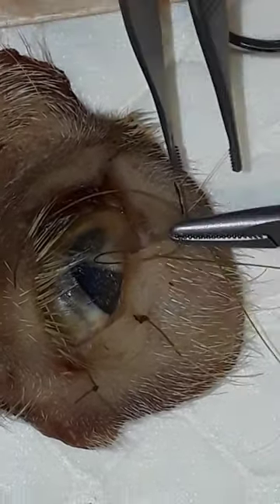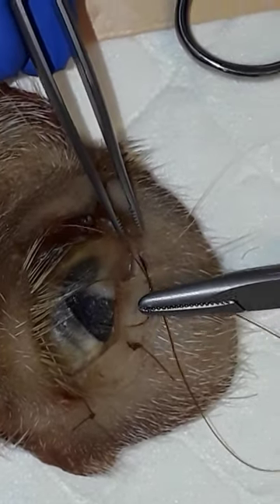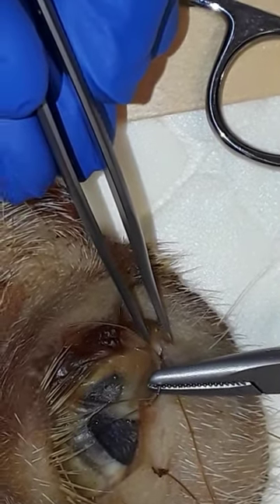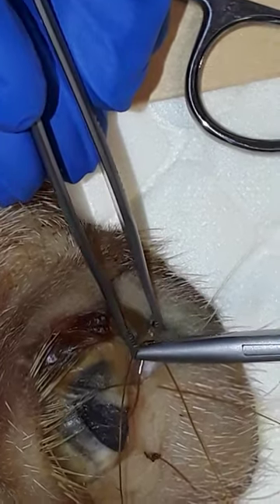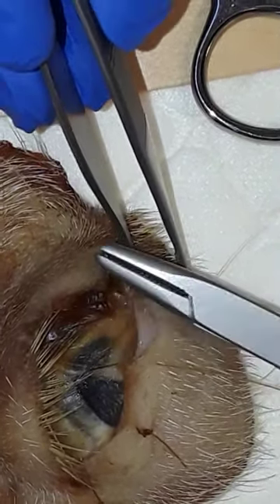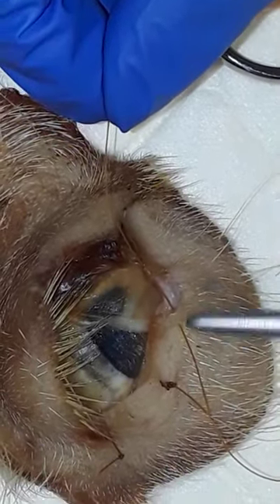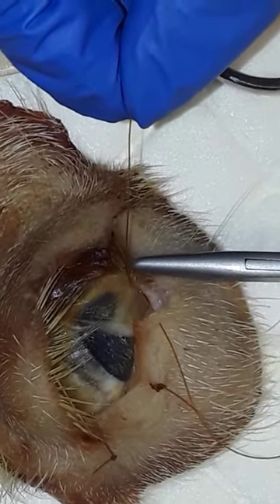Next I'm going to come a little more obliquely and enter the cut edge on the other side of the defect, coming out of the meibomian gland openings, maybe just one or two from the edge. So this is an oblique bite — going across the defect at an oblique angle, first through the skin out the defect, then into the defect and out of the meibomian gland openings.